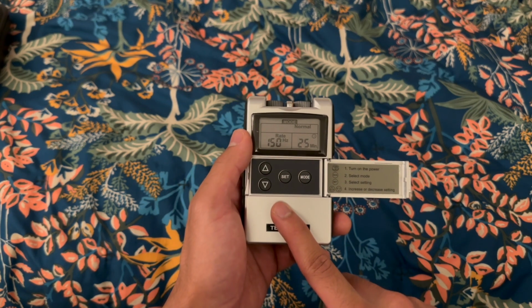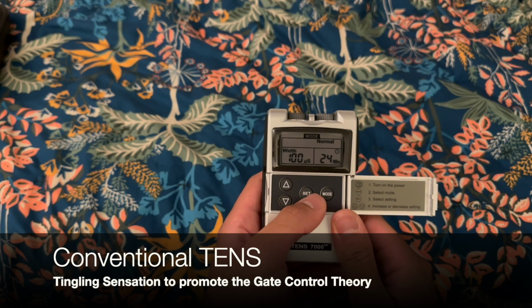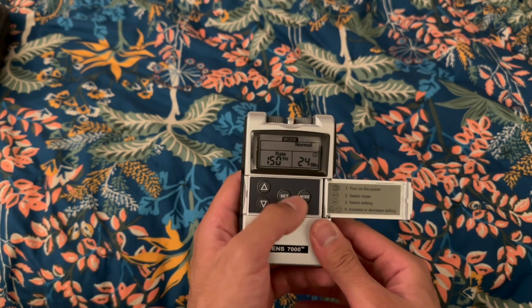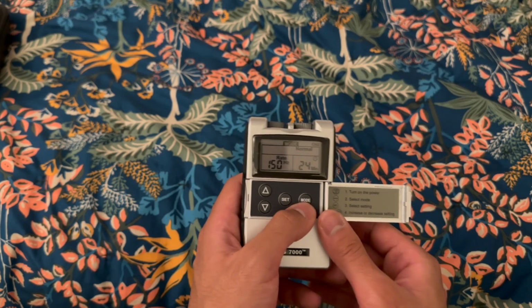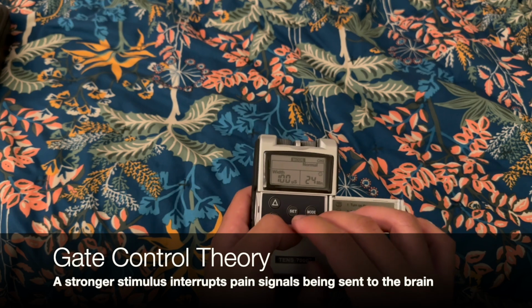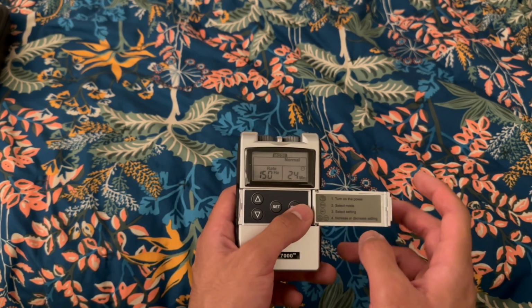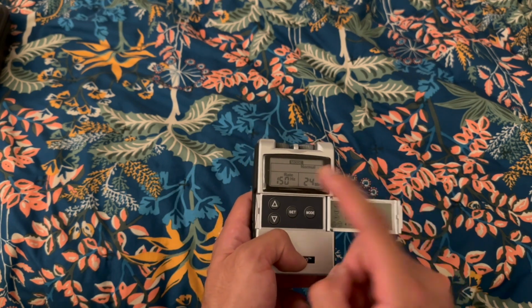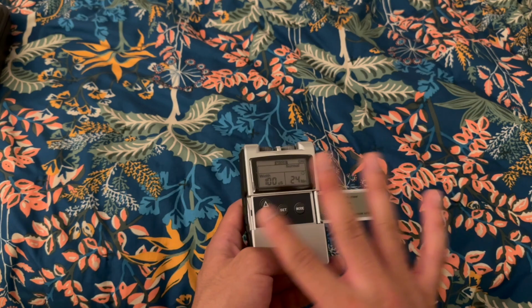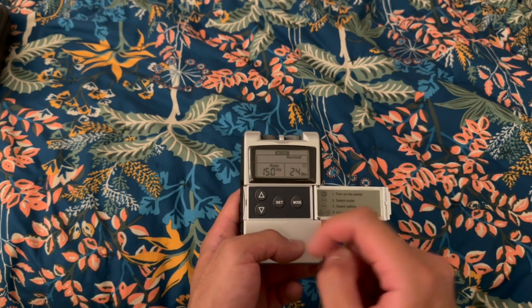Let's talk about conventional TENS. Conventional TENS is going to be this tingling sensation that we're sending to the local area we're treating. This is for the gate control theory. What gate control theory is, it's sending stronger electrical signals that are more receptive to the brain. So that way we're feeling the electrical signals more rather than the pain. So it's pretty much electrical signals beat those pain signals to the brain. That's what we're going to sense.